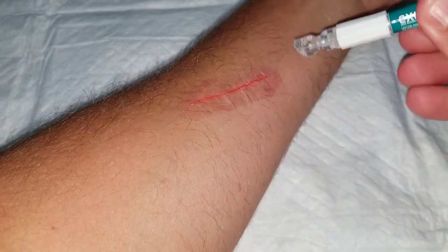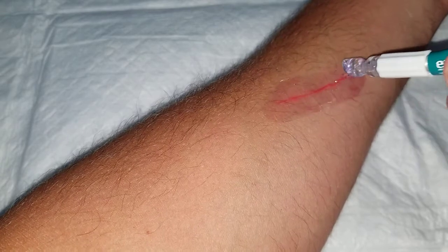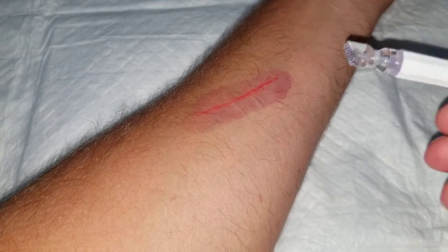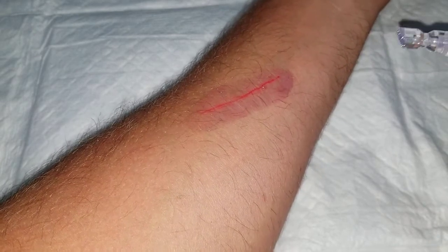What I've seen that works best is you take another tube of Exofin glue, pop the cap on it. We're going to, just like before, gently squeeze it down until we see the glue. Once we see the glue, we're going to apply a light coat just around or on top of the previous Exofin glue, and we're going to let that dry. You can see it gets a lot more purple than it was before. We're going to give that a chance to dry, usually 10 to 15 seconds.